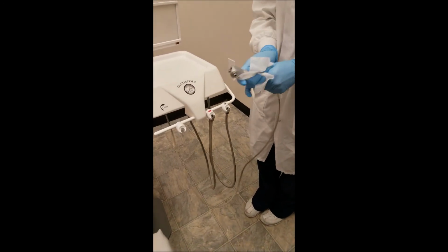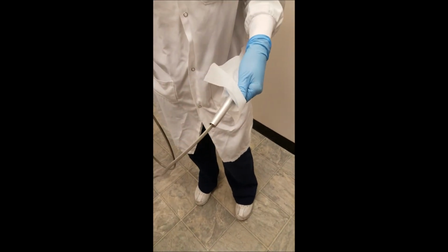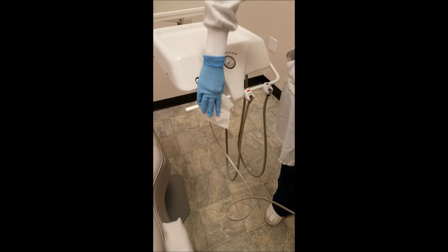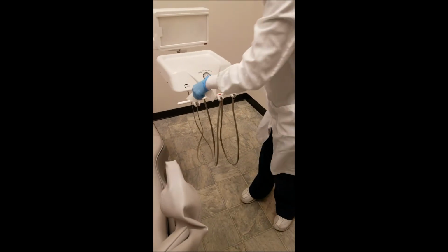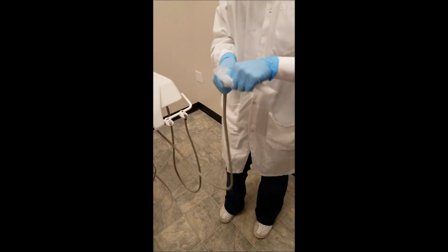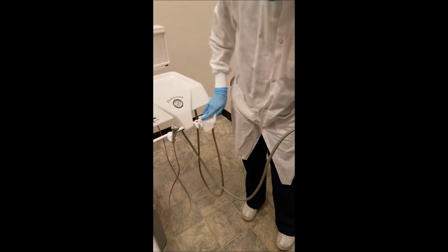So another helpful hint right here, see how she holds this part of the air water syringe with her wipe instead of the glove, because that part's clean, so she can't touch it with her glove. And then she also makes sure to wipe down the holder really good before she puts the clean tubing back in the holder. And she goes all the way to the bottom of the tubing.